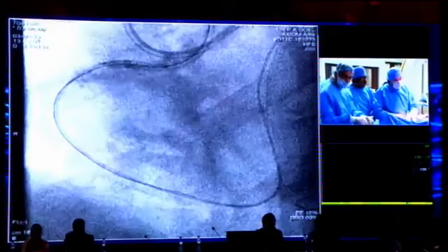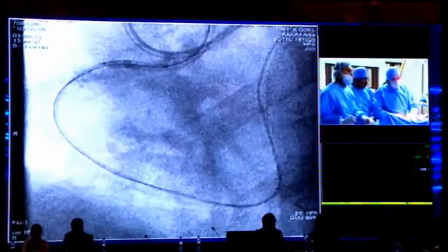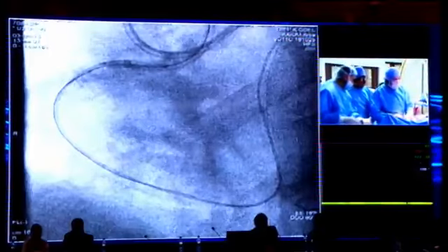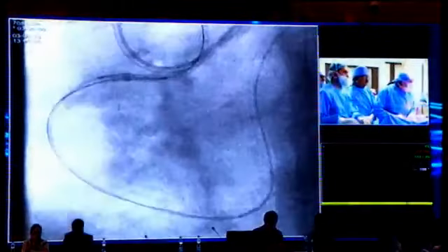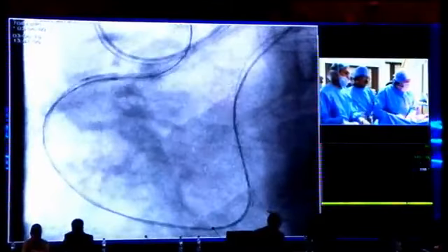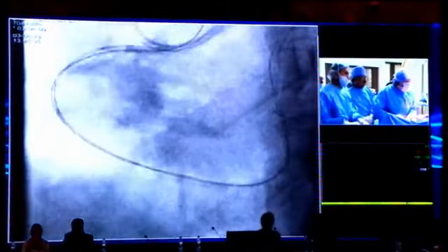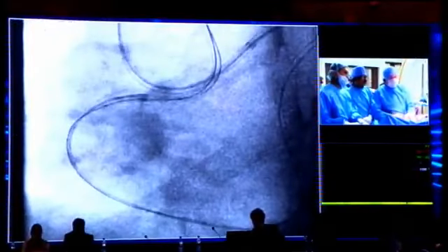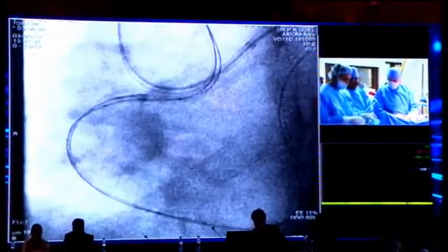So then basically we will try to dilate. I think we will be true lumen all the way. Maybe there will be dissections certainly because we have gone subintimal. Yeah, but we didn't dilate a few times. You didn't see the balloon, the wire is in. Down with the balloon.